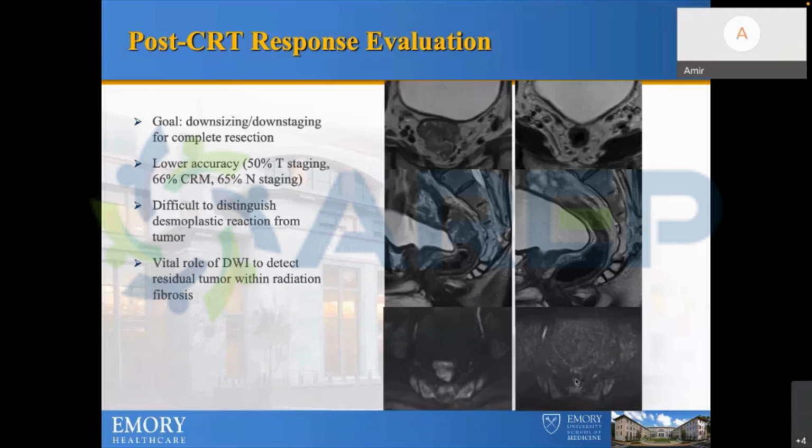So based on what I showed you, there's not much need for gadolinium for local staging, but since we do abdomen pelvis MRI, because our surgeons want to always look at the liver, and for the liver we need to have gadolinium, we always give IV gadolinium, because we want to look at the liver and the abdomen and look for distant metastases. If you're only looking at the rectum, it doesn't add much to the evaluation of the rectum.